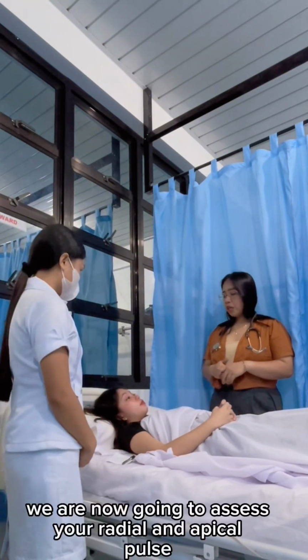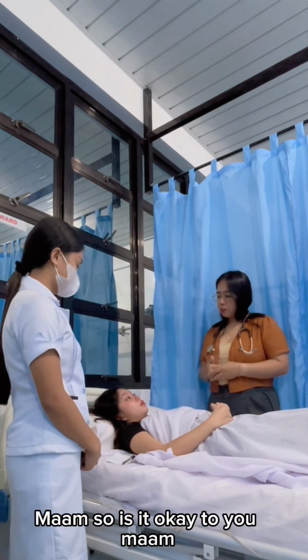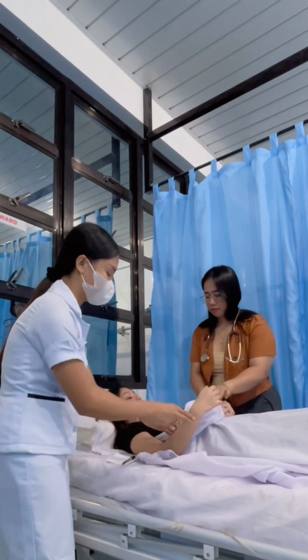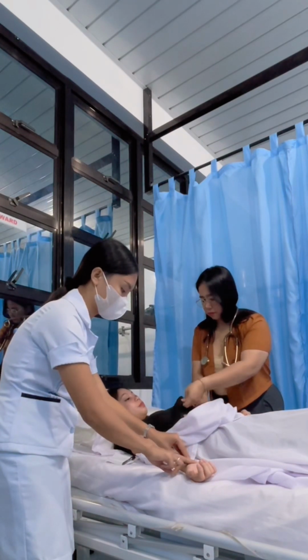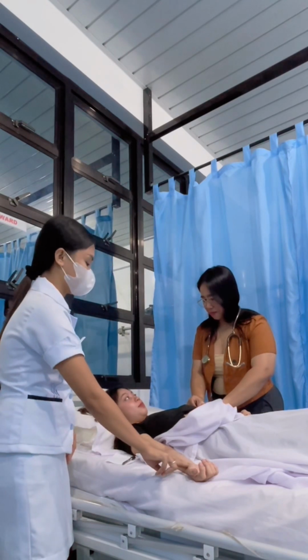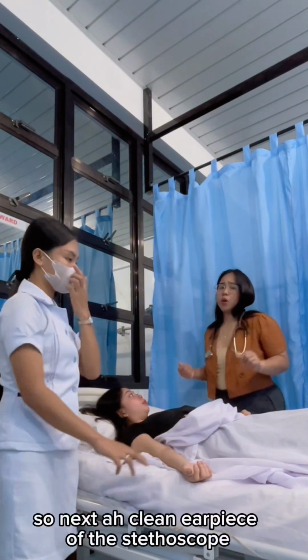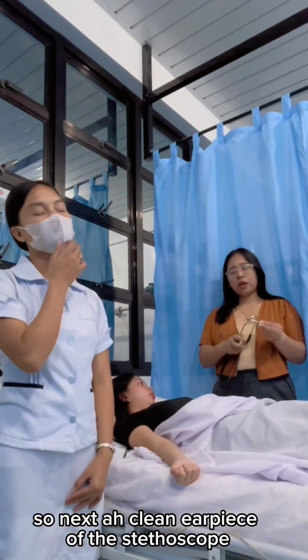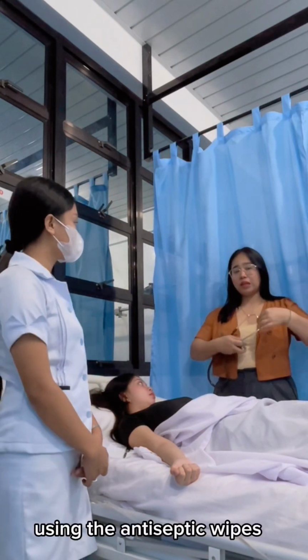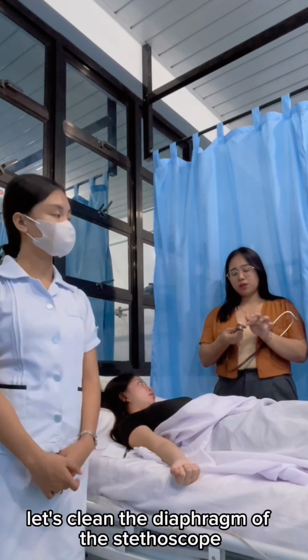So, Mom, we are now going to assess your radial and apical pulse. Is it okay with you, Mom, that we expose your chest area? So, next, firstly, clean the earpiece of the stethoscope using the antiseptic wipes. And next, let's clean the diaphragm of the stethoscope.